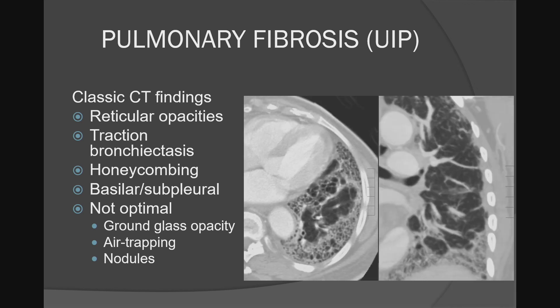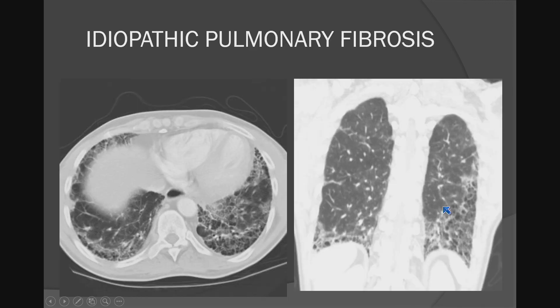This is another example showing many of those things: honeycombing, traction bronchiectasis, areas of reticulation, and also showing that it's subpleural and basilar predominance. If it gets severe enough, the basilar predominance may start to disappear, but that would certainly be the classic presentation. Just another example showing the same thing.